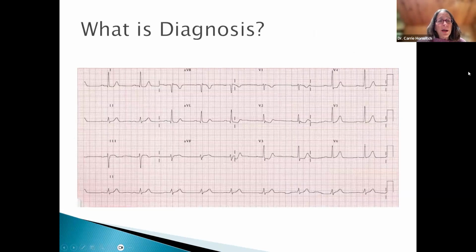Okay, so when we look at her EKG, again, rate, rhythm, axis, and then we look for the intervals, and is there ST elevation or depression? The reason to systematically go through that is to make sure we're not missing anything. So obviously, most people would go straight to the ST elevation or depression abnormality here, but you do want to run through the whole thing because, again, the heart rate here is slow.